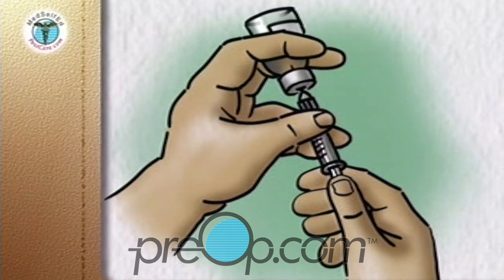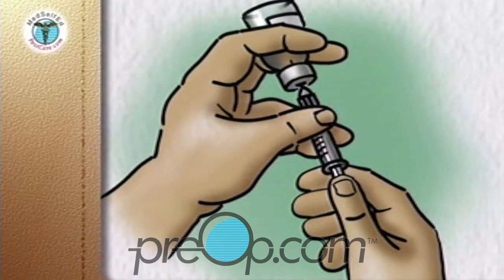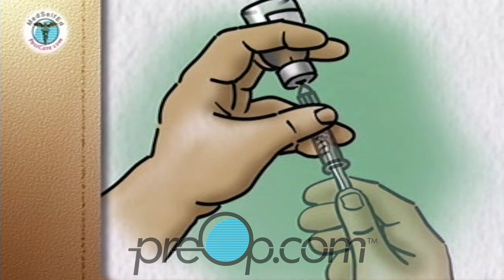Turn the bottle upside down so that the air in it goes to the top. With the tip of the needle kept in the liquid, withdraw the dose of clear insulin — in this example, 10 units. Remove the needle and syringe.